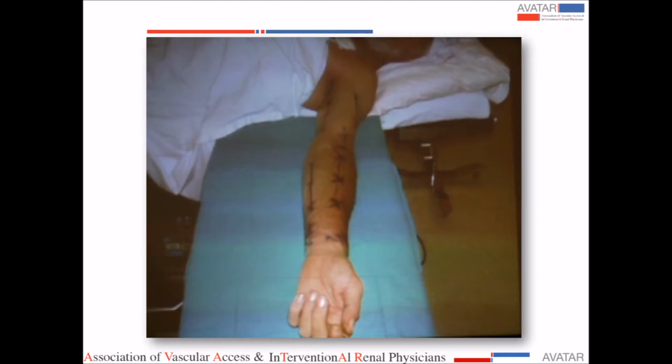And then the other question is the use of the tourniquet. There are some people who will start off the vein mapping with sequential tourniquets, starting off here and then moving it up. I do not start with a tourniquet. I will do the vein mapping, and if I have adequate numbers without a tourniquet, that's good enough. If I don't get adequate numbers, that's when I'll use the tourniquet and give both results so we can see that the vein is capable of dilating if there is augmentation.